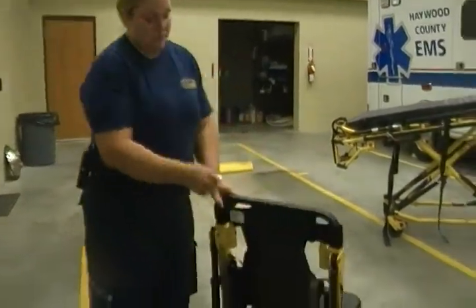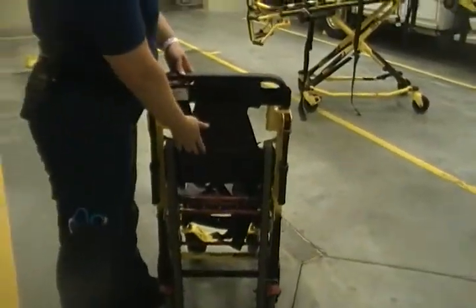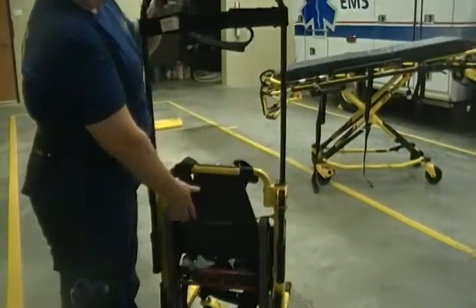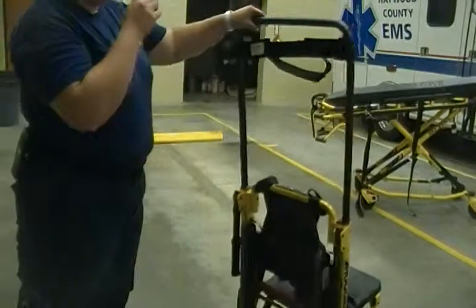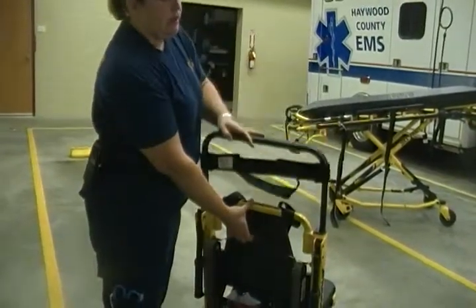Here on the back part of the stair chair, you'll find a bar up here at the head. With this bar, you want to take this lever and gently pull on it, and it lifts it up to an upright position. This can be used to lean the patient back and roll them, or to roll them down the flat of stairs. To release this, you let it down.